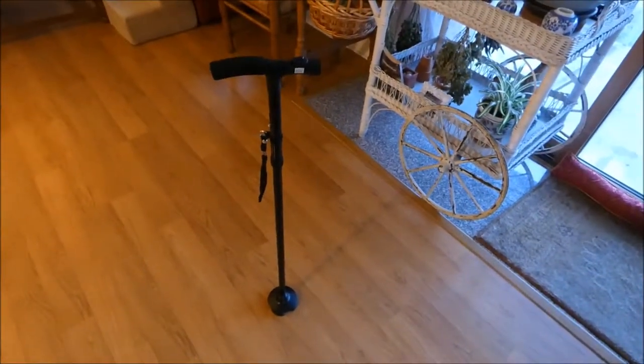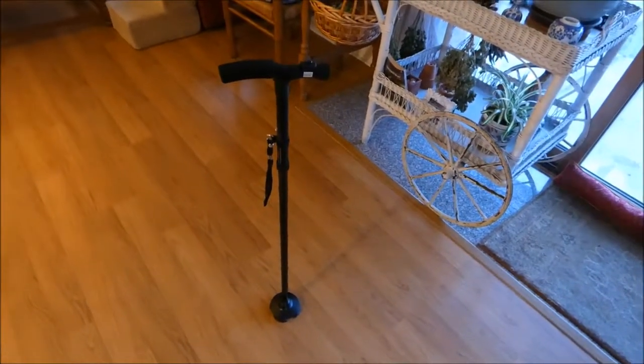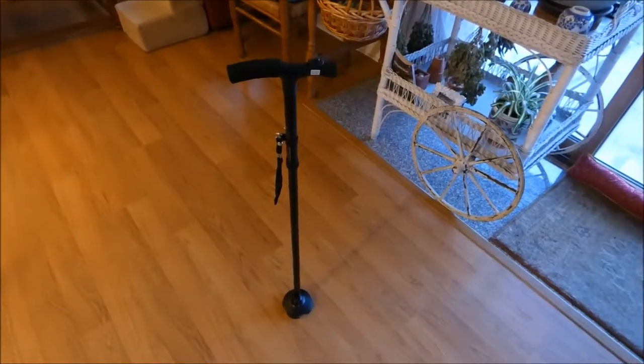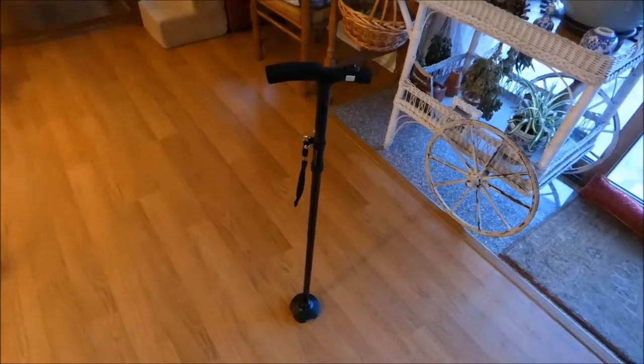It stands on its own — so nice. I have enough to think about without my cane continually falling onto the ground. That's really great.